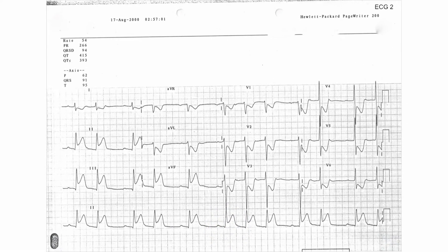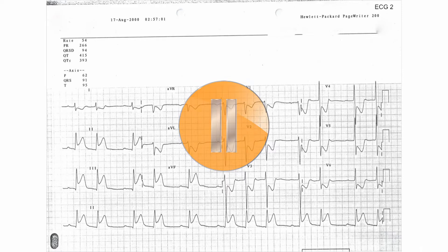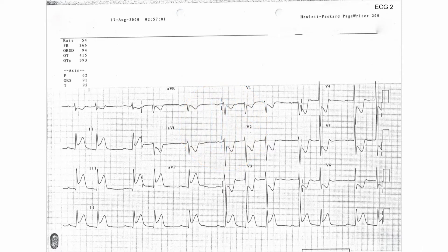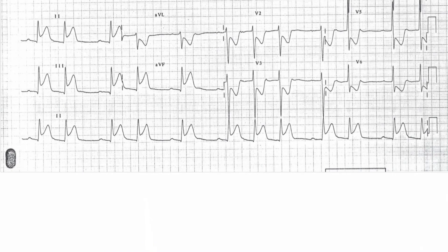This is an ECG recorded from a patient with chest pain. Pause this recording now and interpret the ECG on your own before pressing play again to hear the interpretation. The rate is 72 beats per minute. You'll notice that the computer has got this wrong.